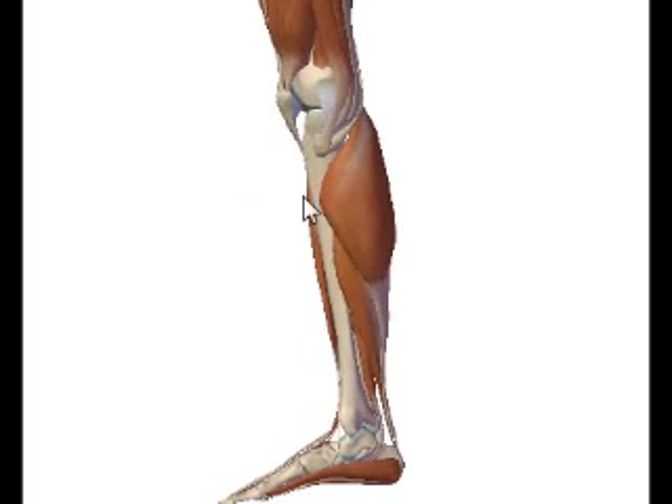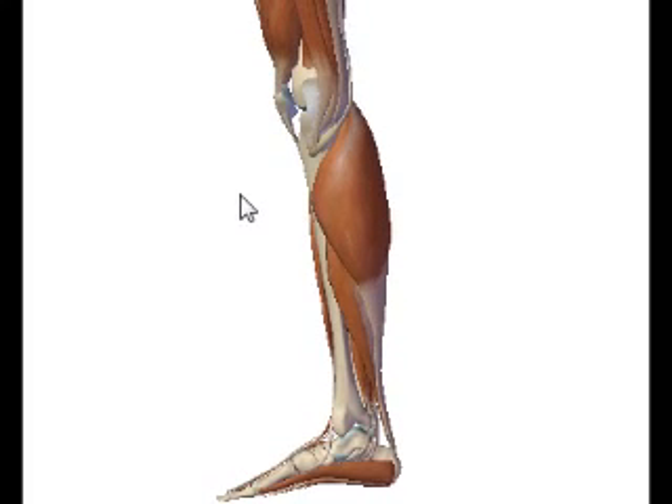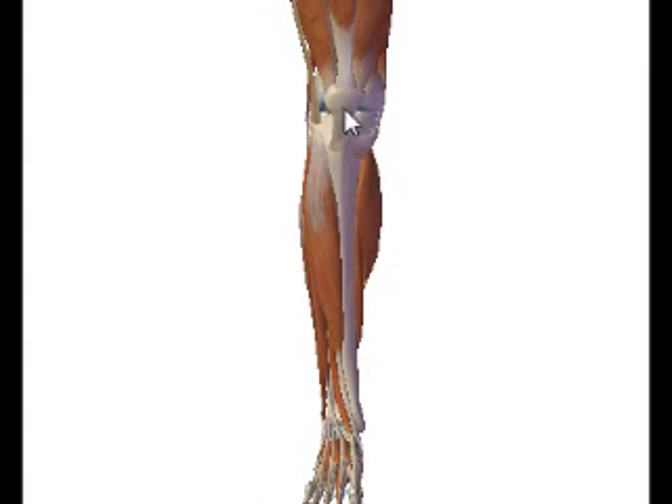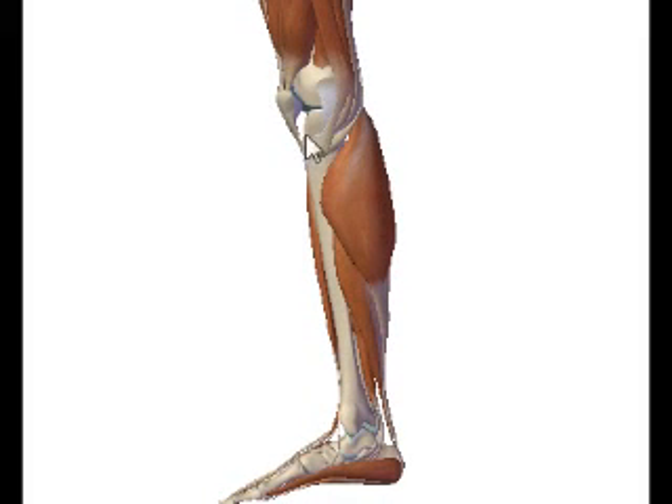Your positioning is pretty much going to be just the same as it would be for a non-weight-bearing, more or less. The knee is going to be straight, not flexed, so that kind of moves the patella around a little bit, but you can still virtually use the same positioning. You're going to use the patella for your up and down centering — use the distal tip or the apex of the patella. That's going to be pretty much your centering point.